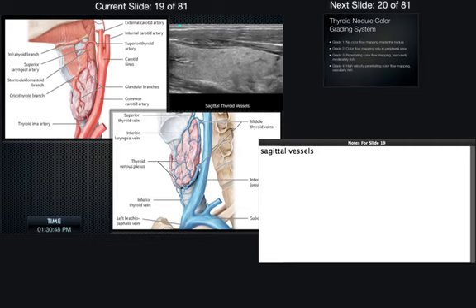So in the sense that if I lower my PRF, if I'm not talking as much and I'm listening more, I'm a more sensitive individual because I'm listening more, and so is the Doppler on the ultrasound machine. So low pulse repetition frequency, better sensitivity, okay? Just keep that in mind. PRF, you're going to come across that PRF all over the place next year.